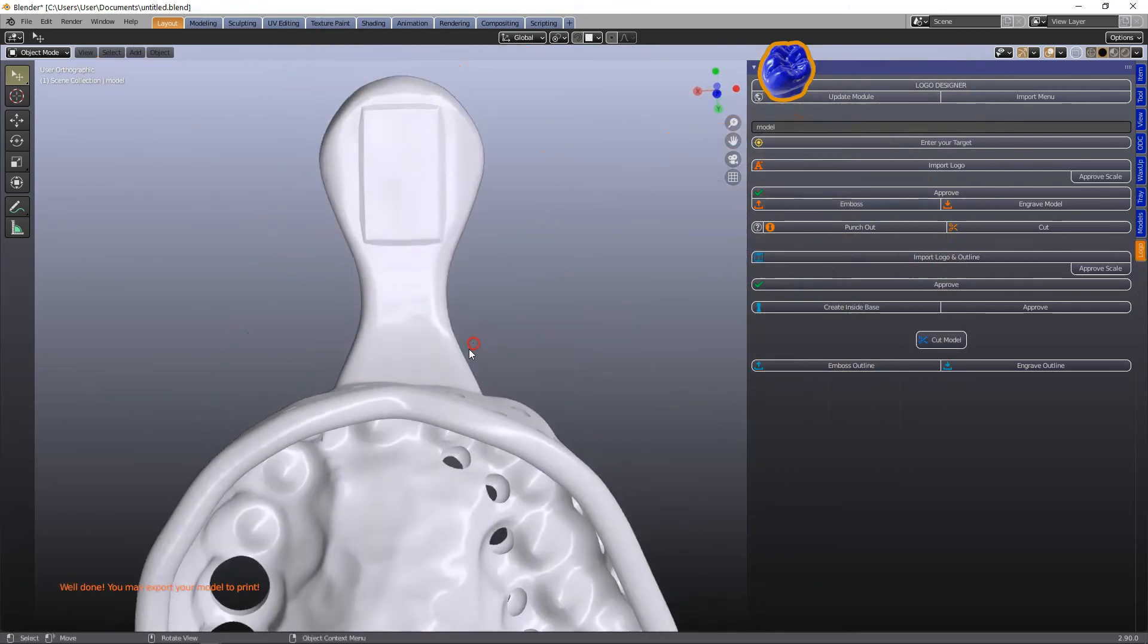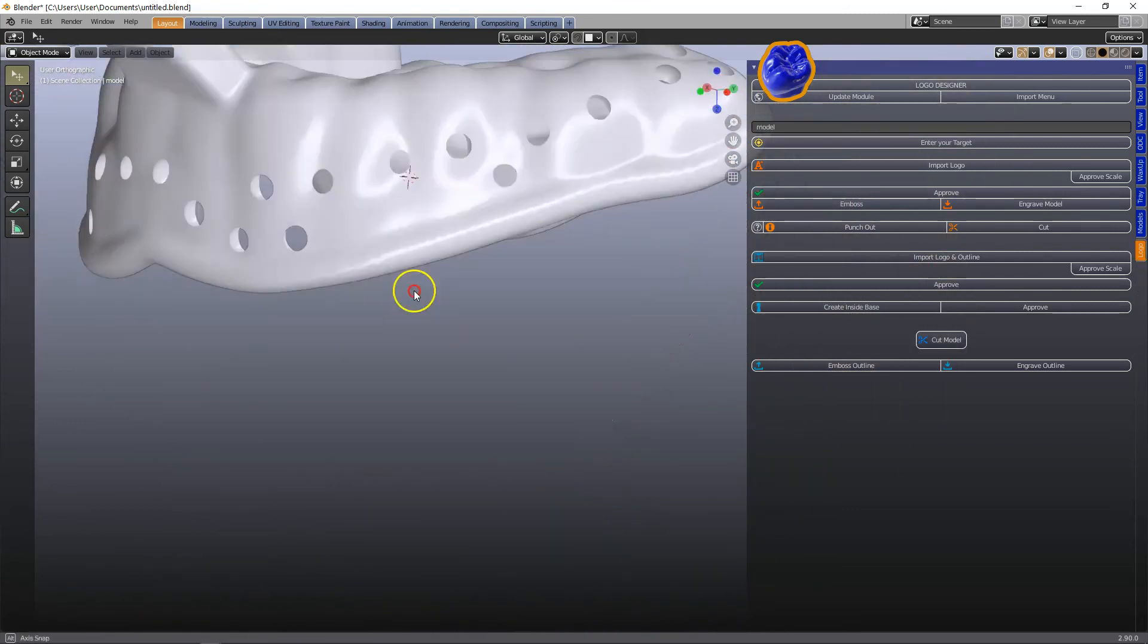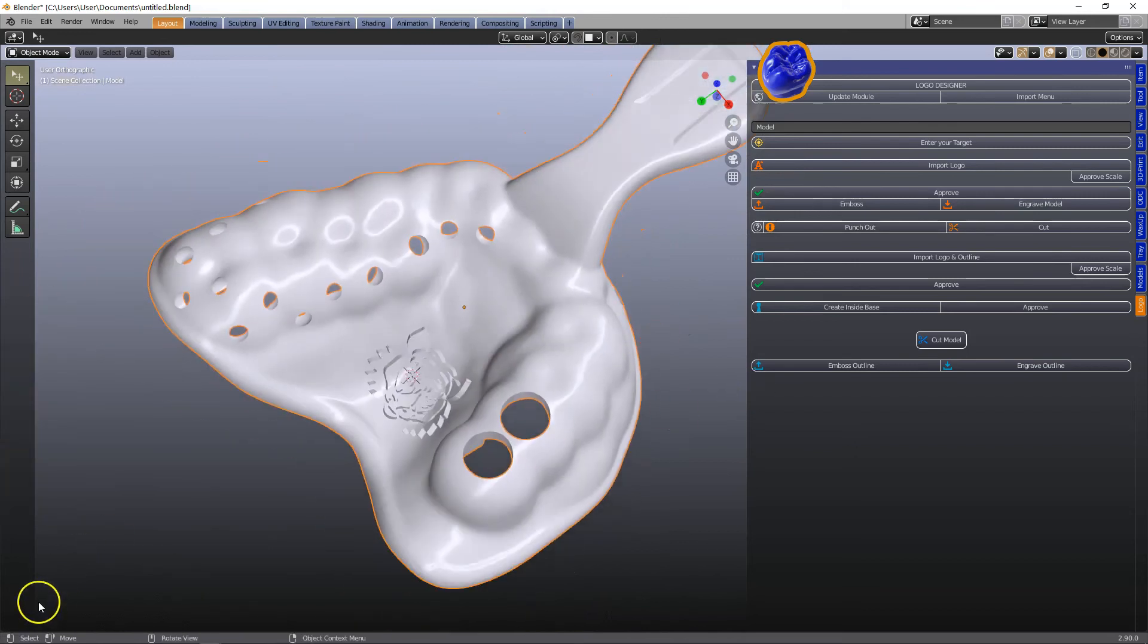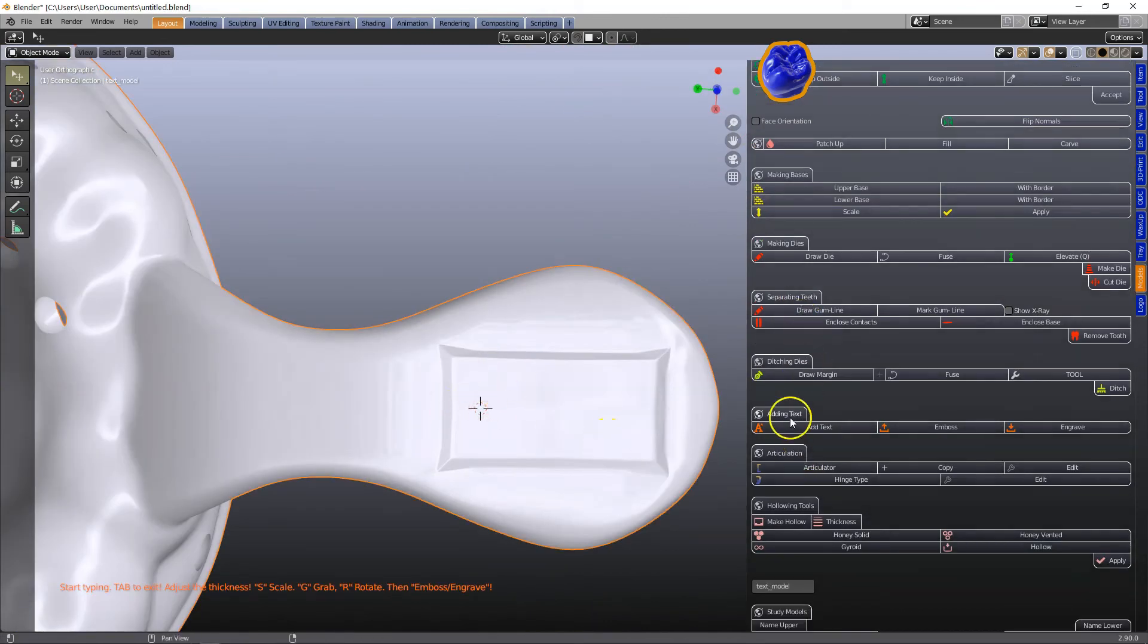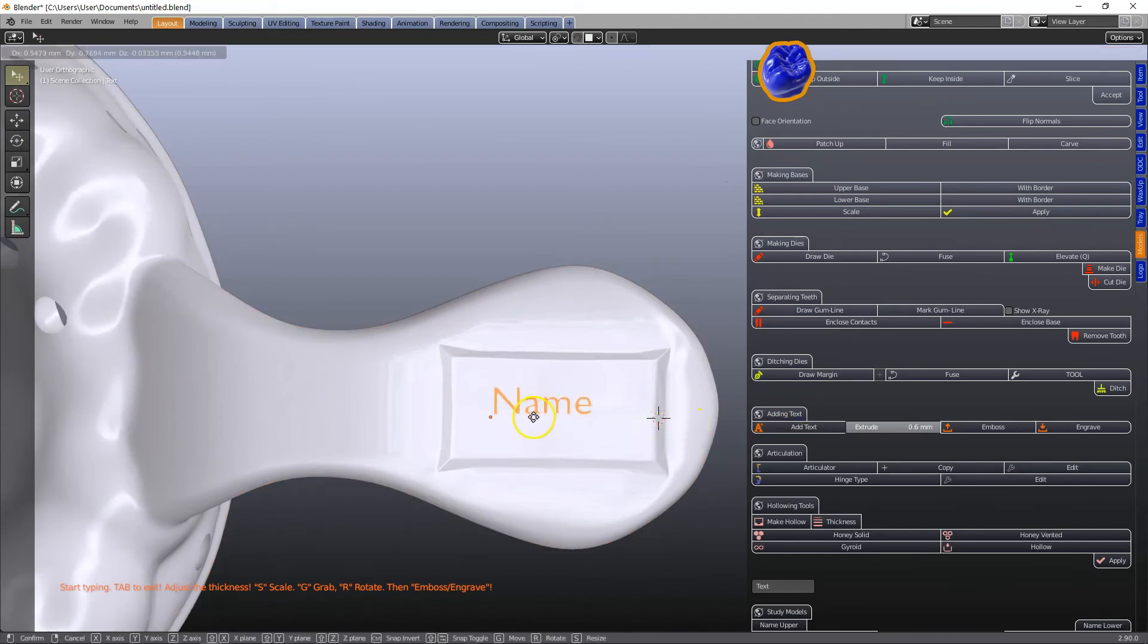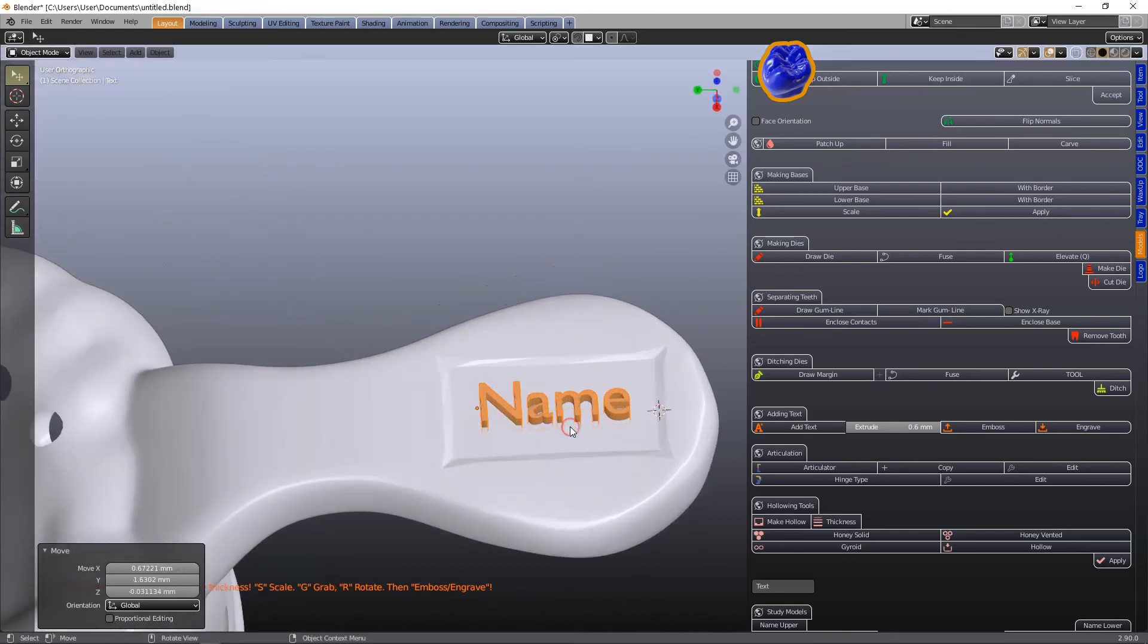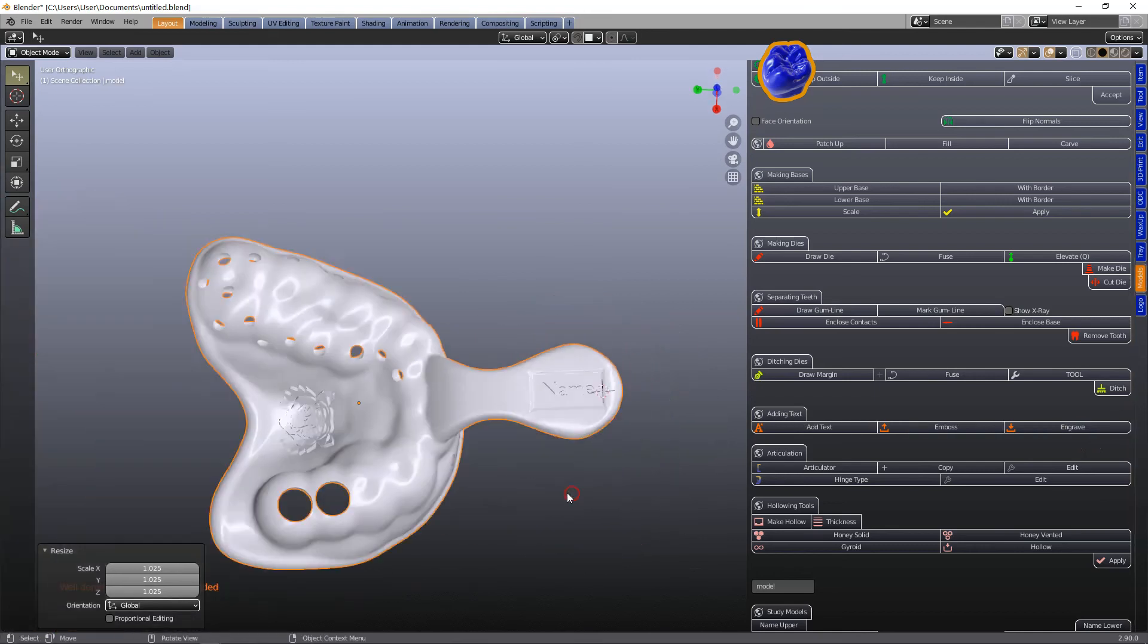And then finally we're going to put the name on top of the handle. In the model designer click add text. S to scale. G to grab. And let us for fun just engrave this into the handle.